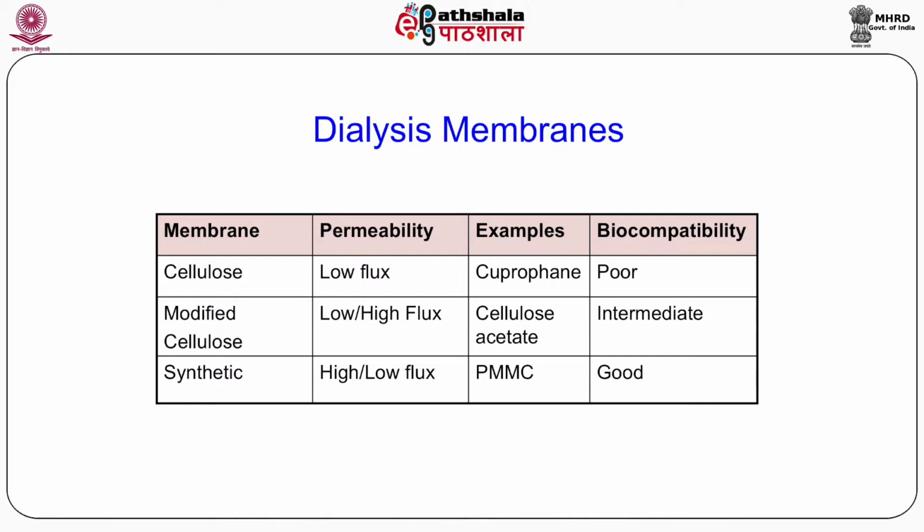An example of a middle molecule is beta-2 microglobulin, which is normally filtered by the kidneys. But in renal failure, what would happen? This molecule will start accumulating in the patient's blood and can end up causing a lethal disease called amyloidosis. Hence, middle molecules also need to be filtered, which is being taken care of by the newer membranes we are using for hemodialysis. The second property that we would be discussing is the property of biocompatibility.